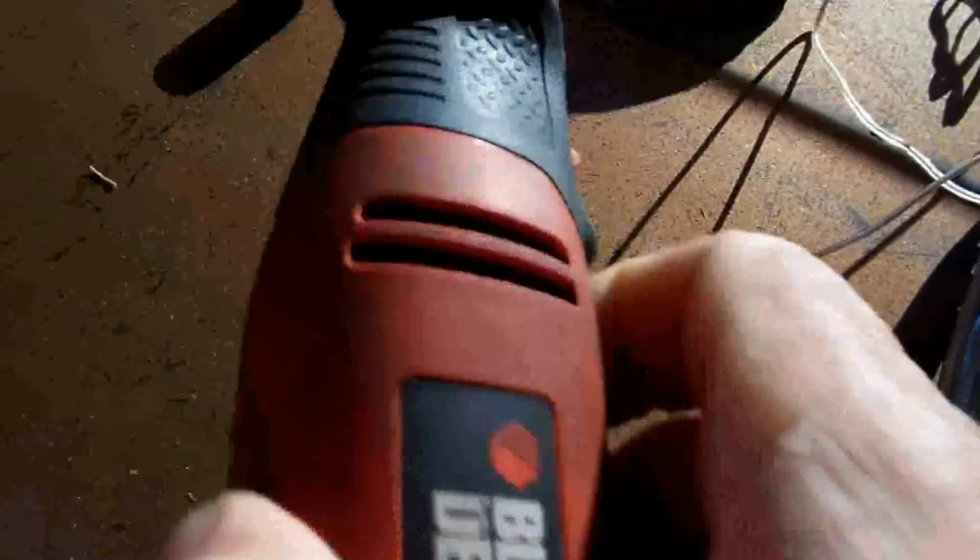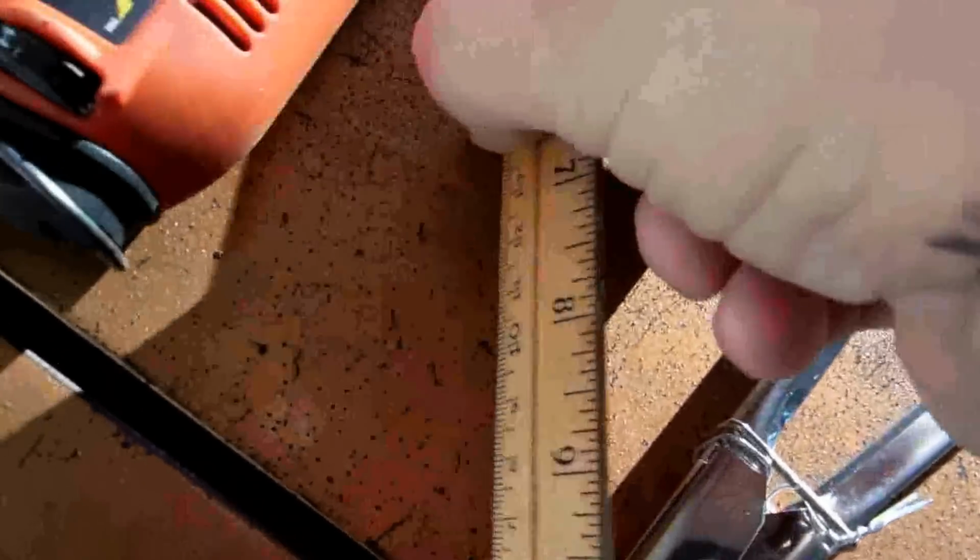What I did was I used a Dremel tool, and it's got a cutoff wheel. It's kind of worn down now that I used it, but I got these stainless steel tongs from Walmart for like 97 cents, and it's thin stainless steel. I just cut along here. I cut out a strip, and you can see it's right to specification basically.